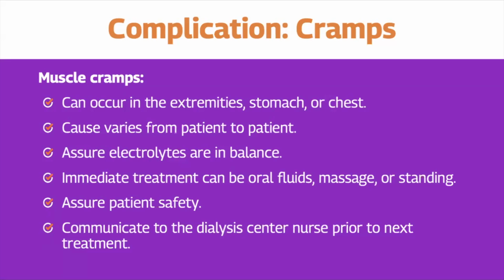An immediate treatment would be to give them some oral fluids, massage the cramping calf or leg, or have them stand. Standing, though, can be dangerous, especially if they have any dizziness or are volume depleted. So just a caution there. If you stand them up, watch to see how well they have balance. You want to assure patient safety during cramping and communicate to the dialysis center nurse prior to the next treatment that the patient had cramps when they got back home.